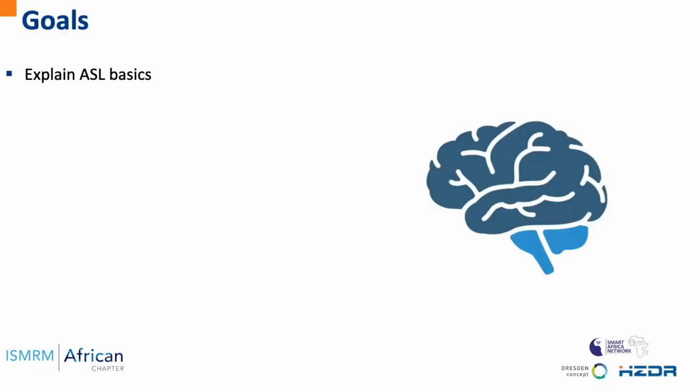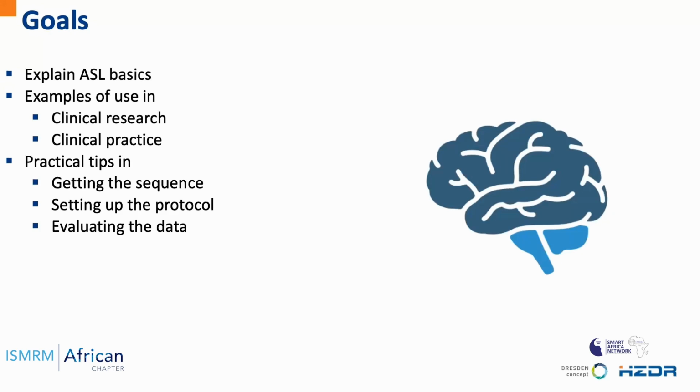I will first explain the basics of ASL, then show you some examples of how to use ASL in clinical research and practice, and I'll finally give some practical tips on how to get the sequence, how to set up the protocol, and how to evaluate the data.